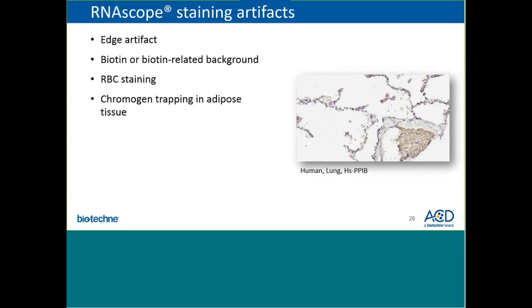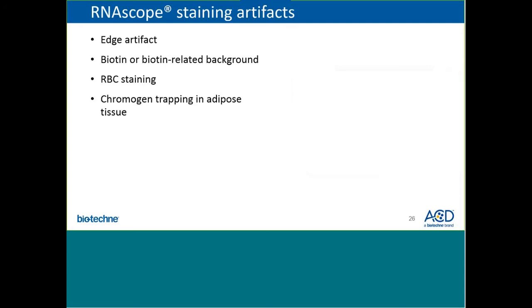The last artifact worth mentioning that you may encounter is red chromogen trapping in adipose tissue. This is not a true signal — the red chromogen will be very finely granular as opposed to the punctate signal seen with the true RNA signal.